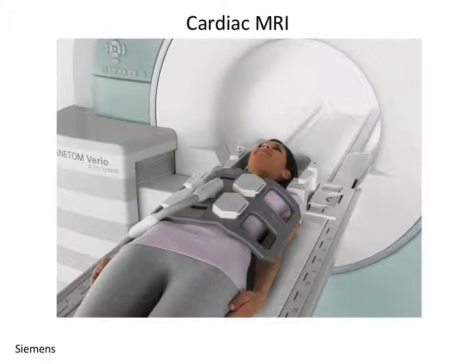And what isn't shown in this photograph is usually this patient would have three ECG leads on her chest here and a cable coming out to feed an ECG into the scanner for triggering. So this is a very idealized picture, as you might imagine.